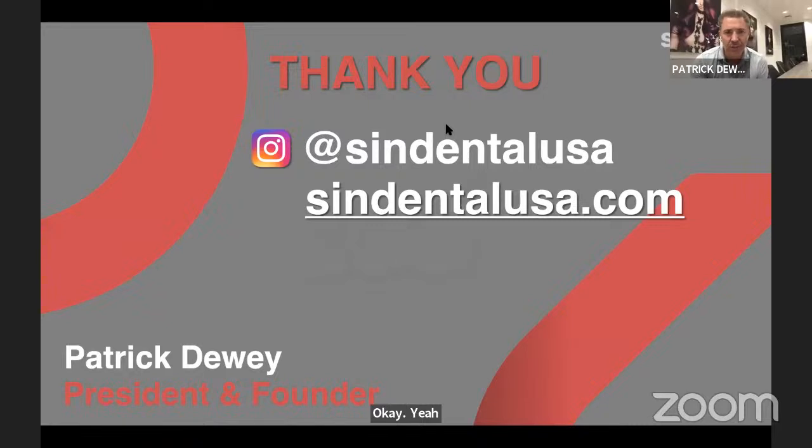We have a few more questions here. If I use the 1.6 millimeter screw, can the micromapper scan body work with the 1.6 size? Great question. No. We are in the process of developing a 1.6 screw scan body. I can't give you a date because I don't know.